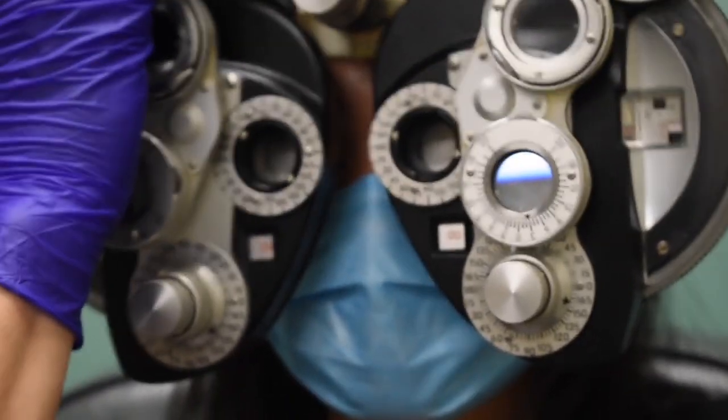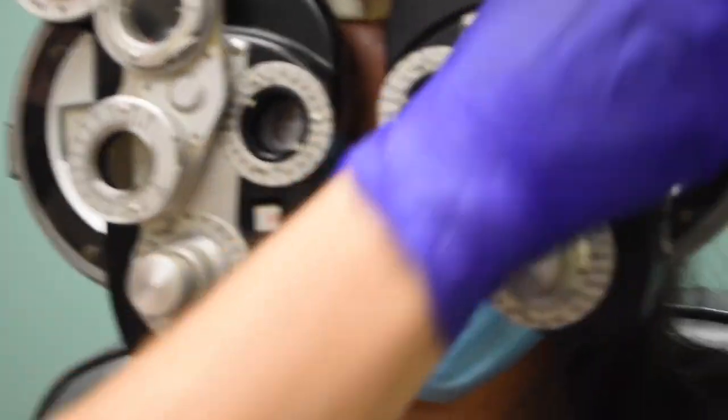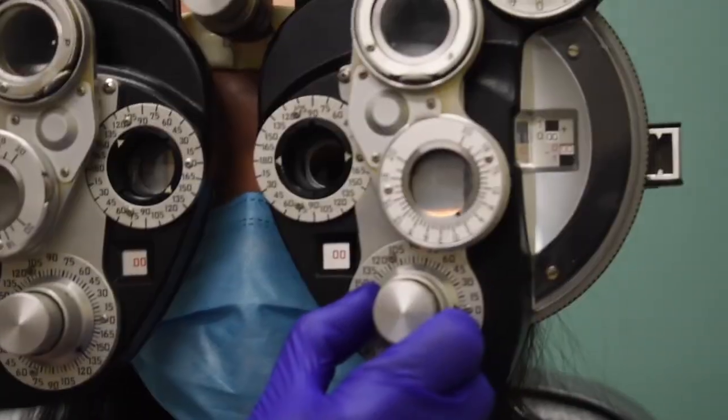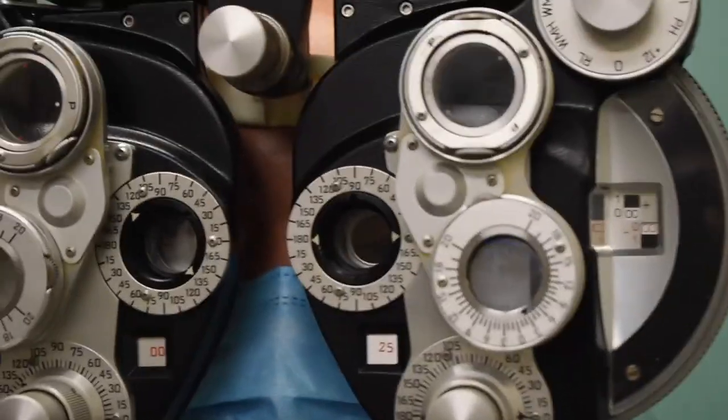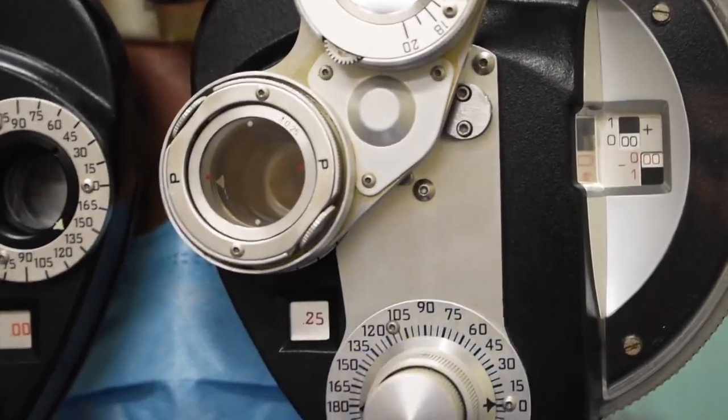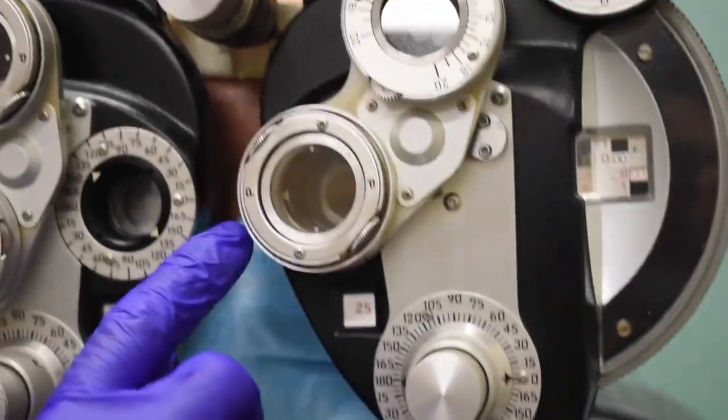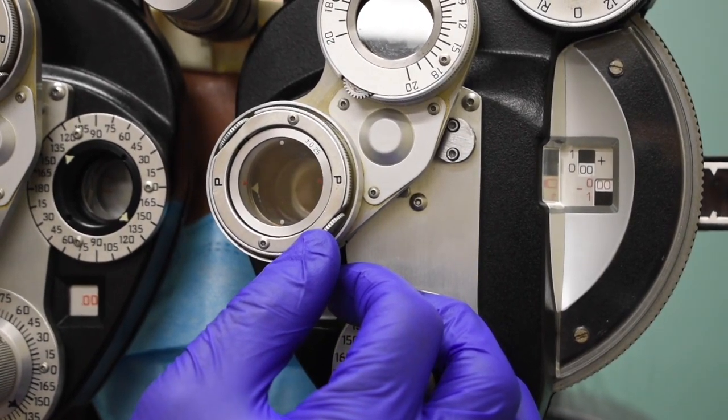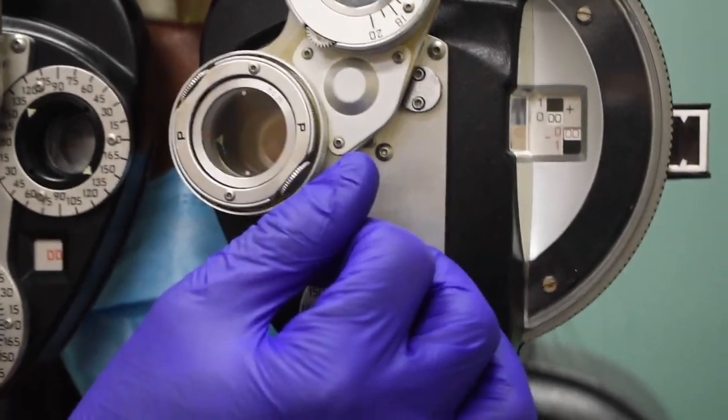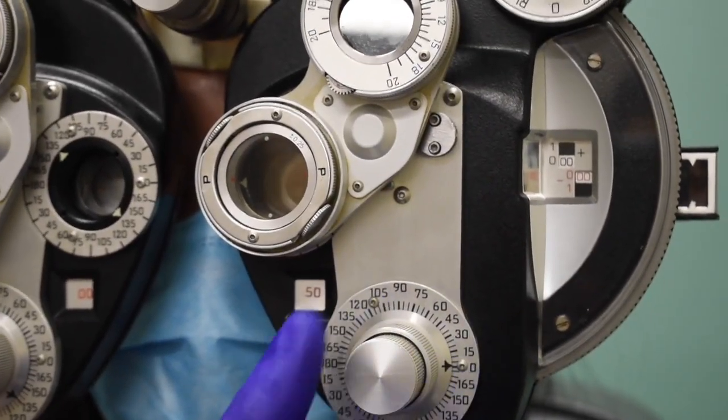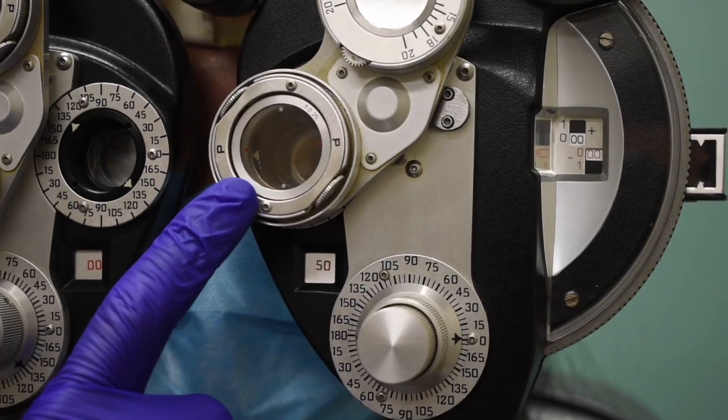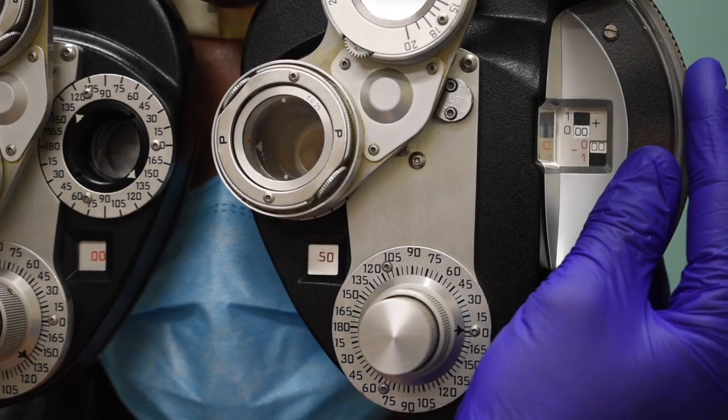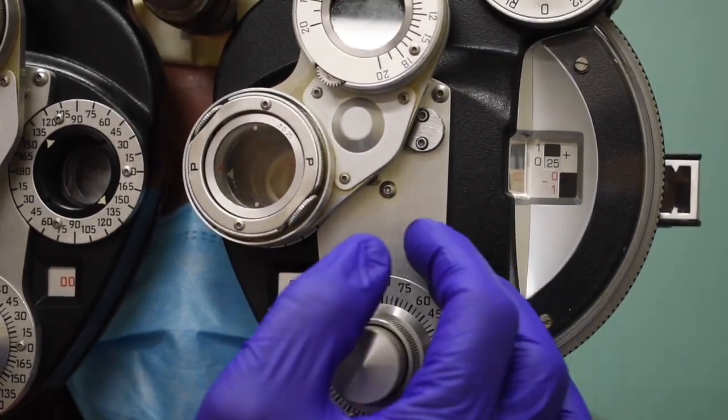Now we'll go to her left eye. And you'll notice that Phoebe had no cylinder from her retinoscopy. So the first step is we have to give her a quarter of a diopter cylinder so we can begin the process. And here we're going to go ahead. Everything is lined up. The dots are in alignment with the axis indicator arrows. I want you to tell me are the letters more clear with one here or two? Two. Good. So Phoebe has indicated she does want some cylinder here at axis 180. I've now given her a half diopter of cylinder so I have to maintain equivalent sphere. Add in a click of plus. Here we go.